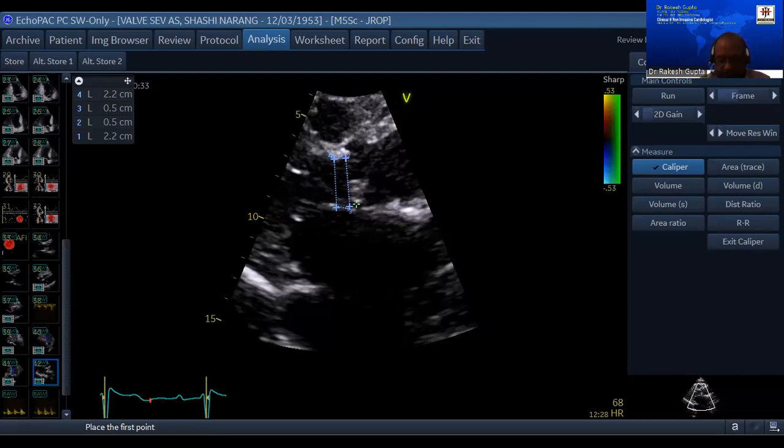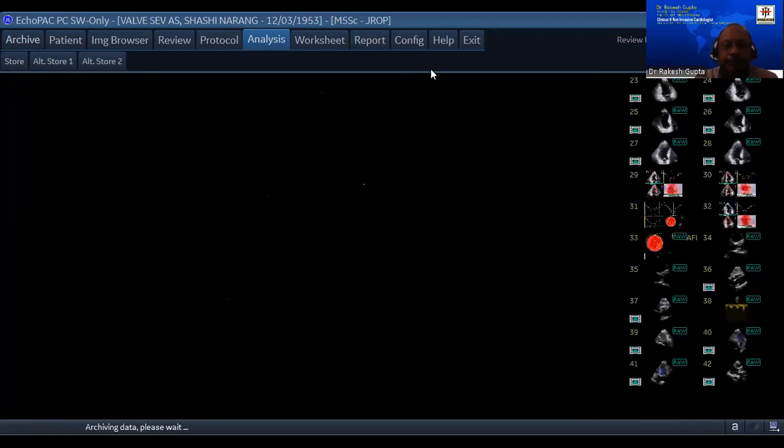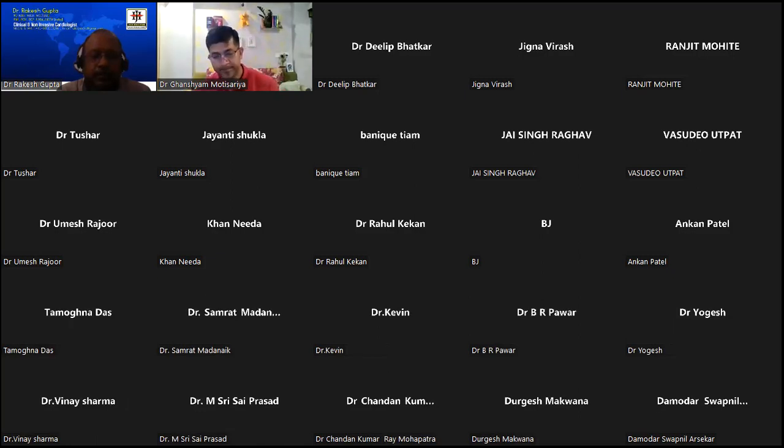Any other question for aortic stenosis before I move to MR and AR? Sir, can you show something about subvalvular and supravalvular aortic stenosis continuous wave patterns? Supravalvular and subvalvular aortic stenosis. Okay. Give me a second.